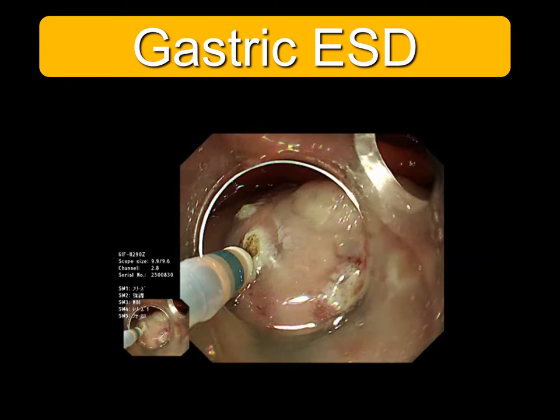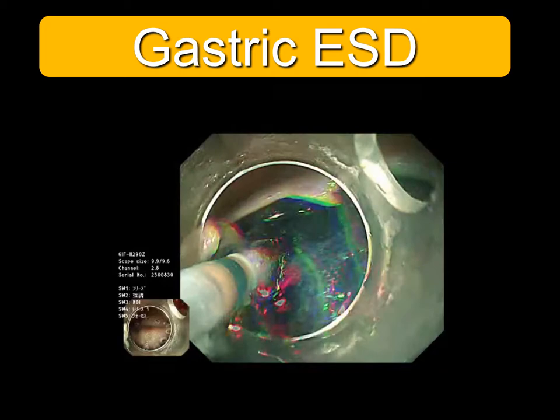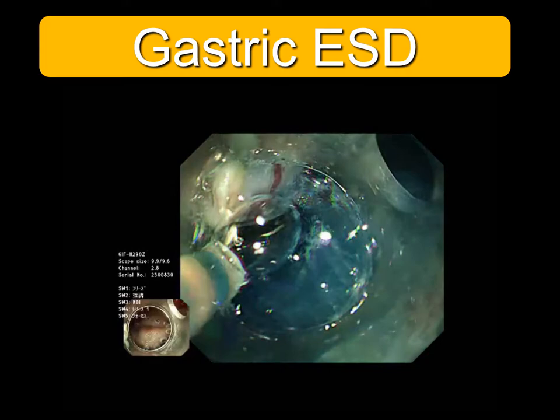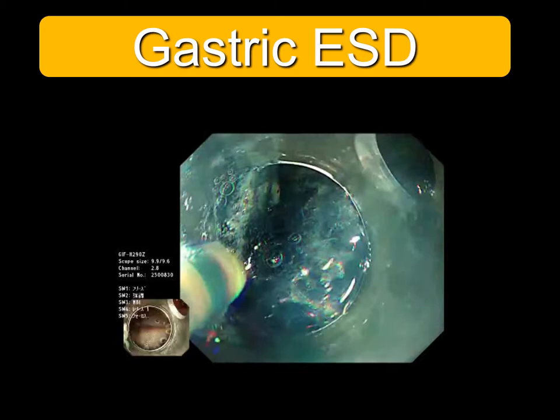I will show you a video of simple gastric ESD. I usually use the dual knife provided by Olympus. Hyaluronic acid or glycerol with blue indigo carmine is injected into the submucosal layer, so you can see the blue submucosal layer. The addition of blue indigo carmine to the solution for local injection makes it easy to distinguish the submucosal layer and muscle layer.